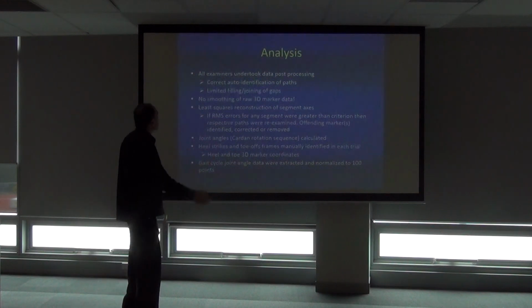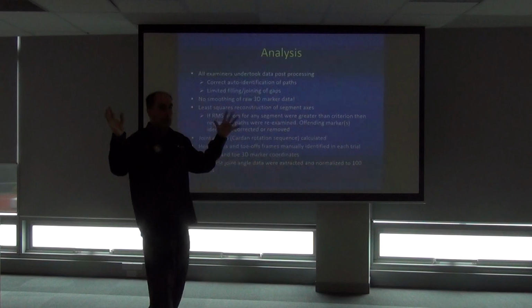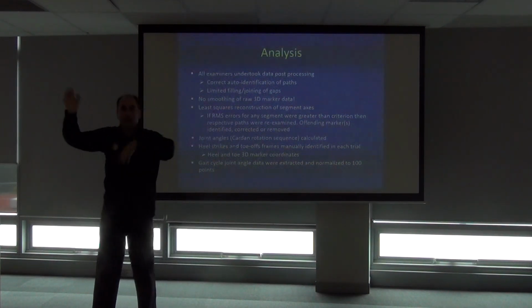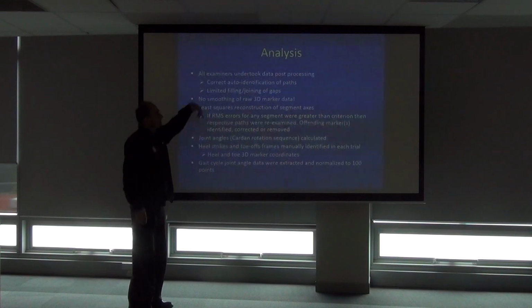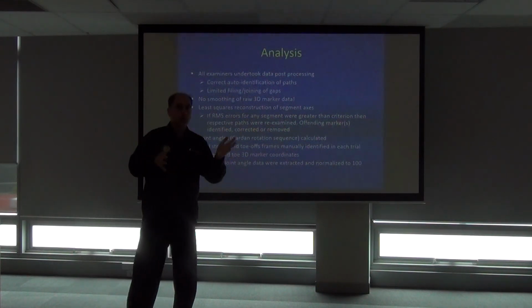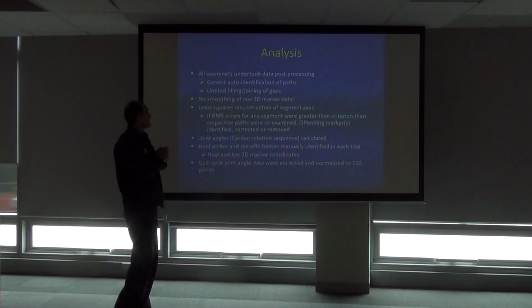Analysis, we're going to go through this really quick. All the examiners, all the group of us, did the post-processing. We just divvied it all up, there's a heap to do, so it wasn't just one person doing it, it was a mixture doing the whole lot. The thing you do is correct the motion analysis system. You make a template and it auto-IDs as you go, but that needs a bit of correcting. So there was correcting identification of markers.